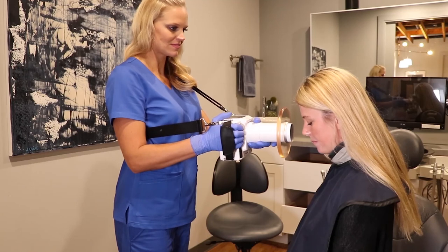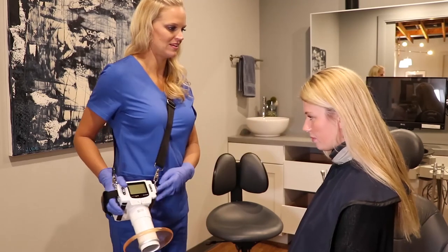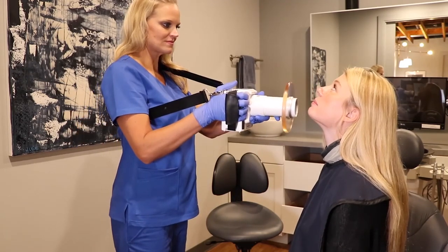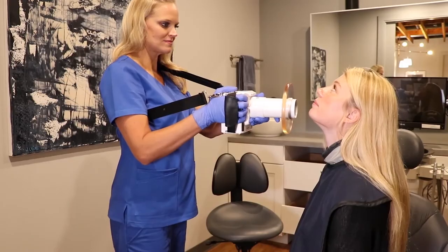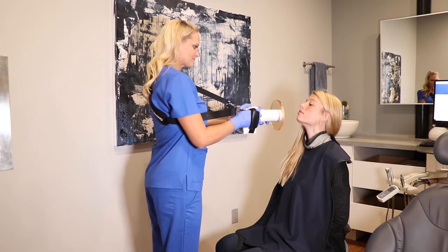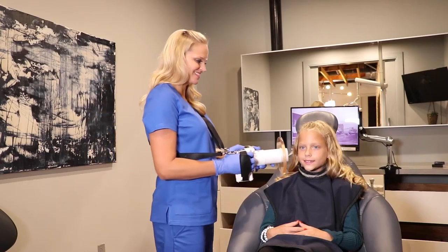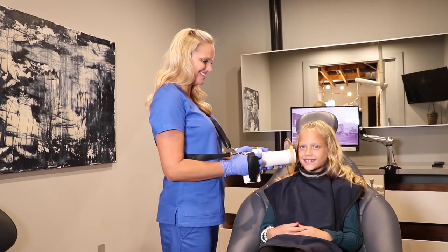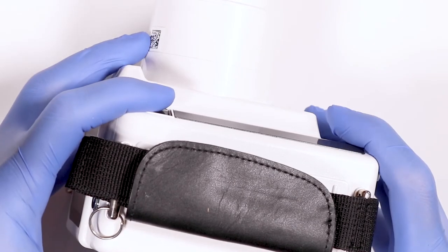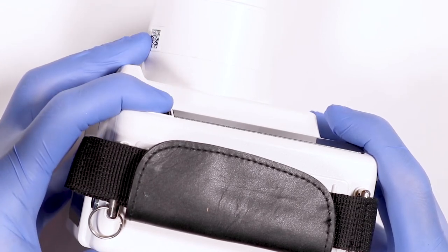You can also turn the patient sideways in the dental chair to ensure the backscatter shield remains parallel to the operator. To take the full series, you may choose to place the patient in a stool where you can maneuver around the patient, maintaining proper position with each exposure. Pedo anterior images, you can position the patient in the chair facing forward. If you are left-handed, you can turn the unit sideways and expose using your left hand.